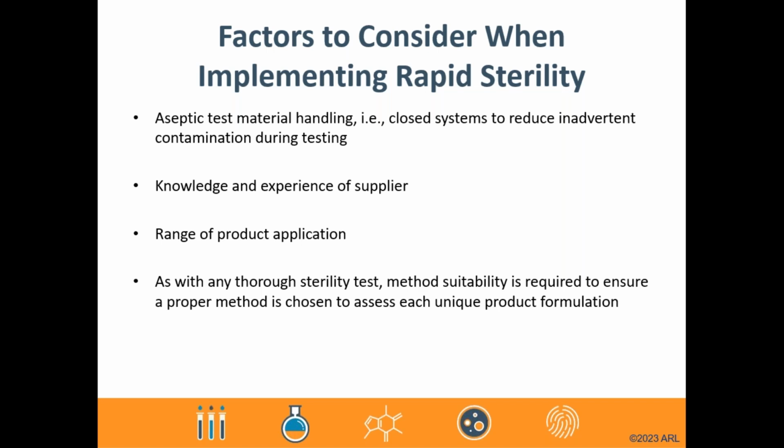Next, if you're using your own lab or a contract testing lab, as with any analytical testing, it's important that you have confidence in the knowledge and the experience of the group actually running the assay. As mentioned during previous slides, various methods allow or limit the types of samples to be tested, filterability as an example. So you might decide, based on your production specifics, does this impact you or your ability to achieve rapid sterility results for your entire range of products?